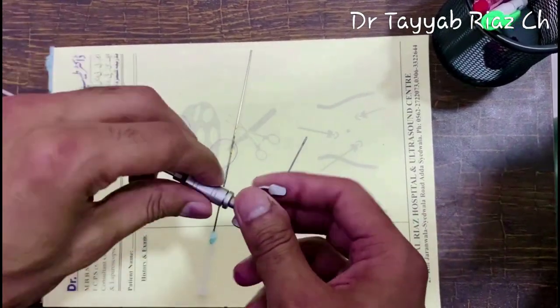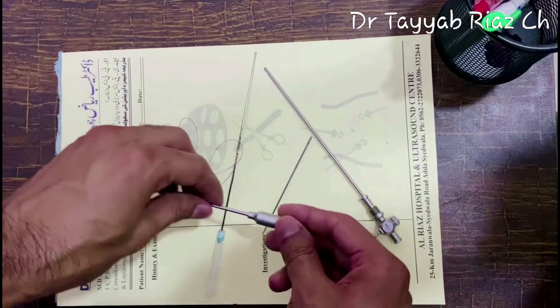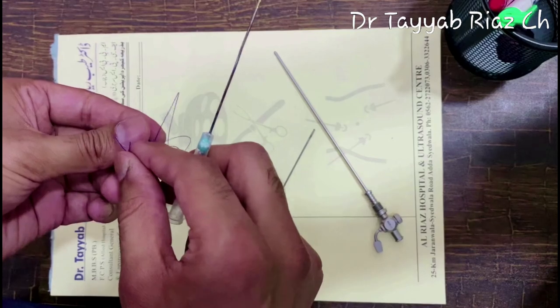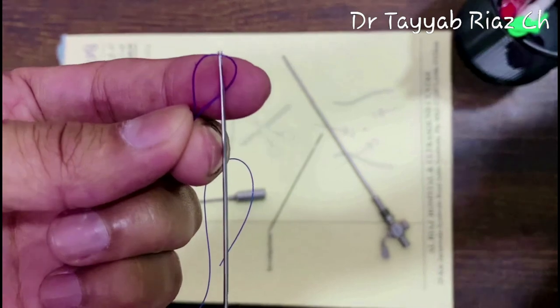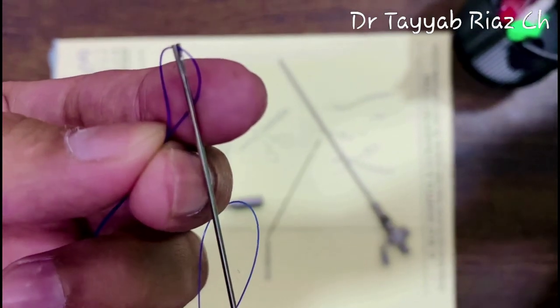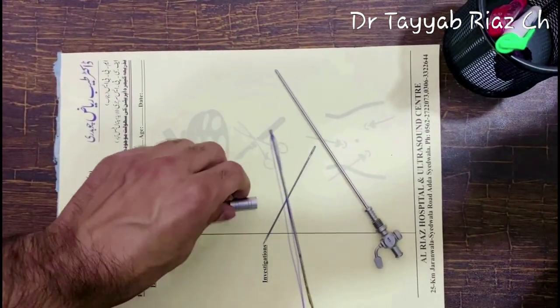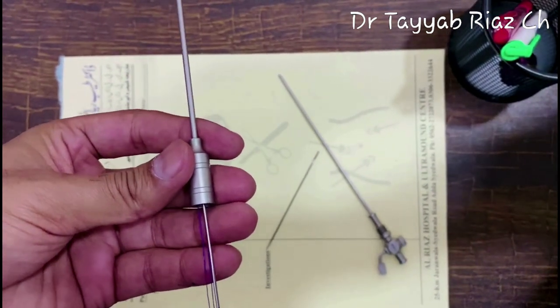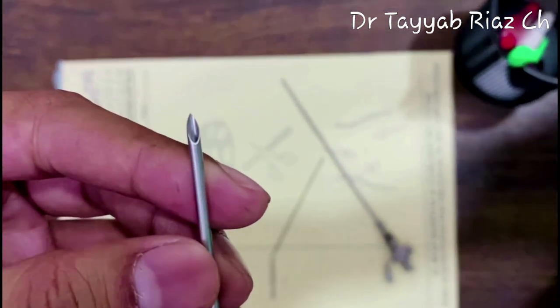Veress needle. To perform this procedure, first remove the inner stylet part of this Veress needle and only the outer needle part will be used. Then take a full length thread and make a loop at the center and feed that loop to the groove of this loop passer. And after that, grab both ends of the thread with the right hand and insert this loop passer at the upper end of the needle, and it will come out at the lower sharp end.